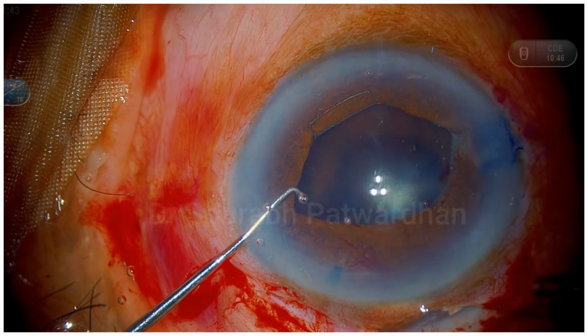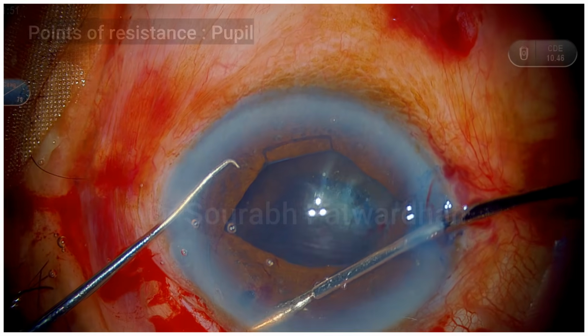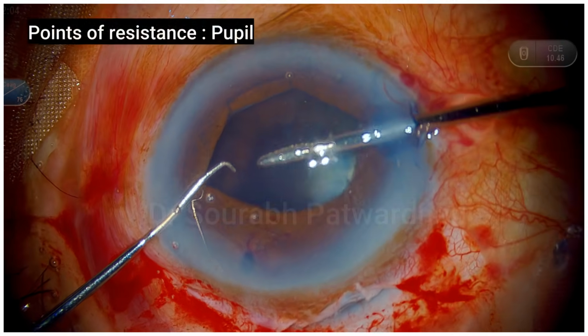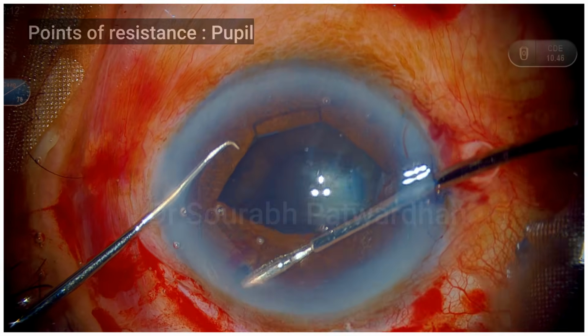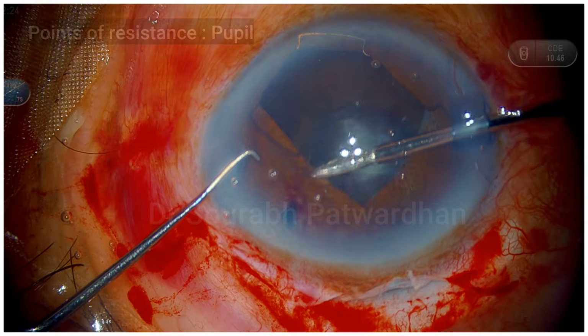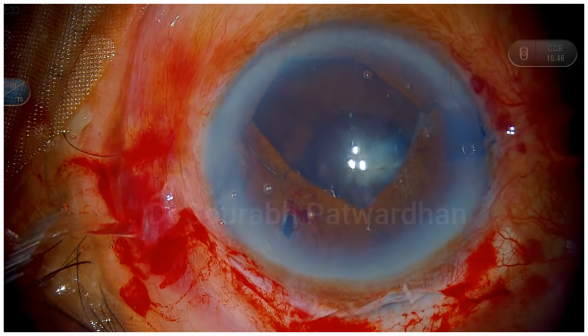So the two flanges go under the pupil, as you have seen. It's not difficult at all. So I'm using a B Octa in this case for the first time, but it's very easy. You can see I'm holding those eyelets there and then pulling them towards the center, and then we have to put alternate flanges under the iris, so it hooks the iris.